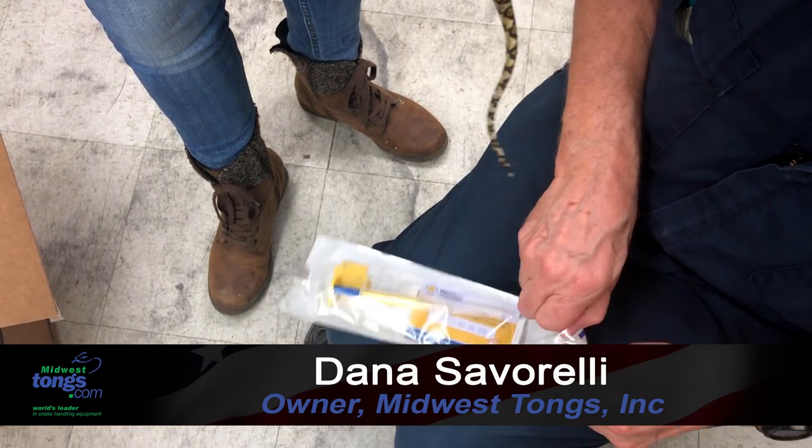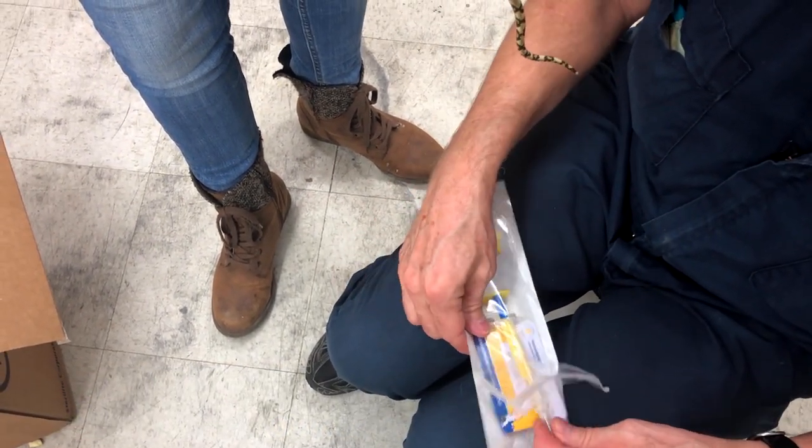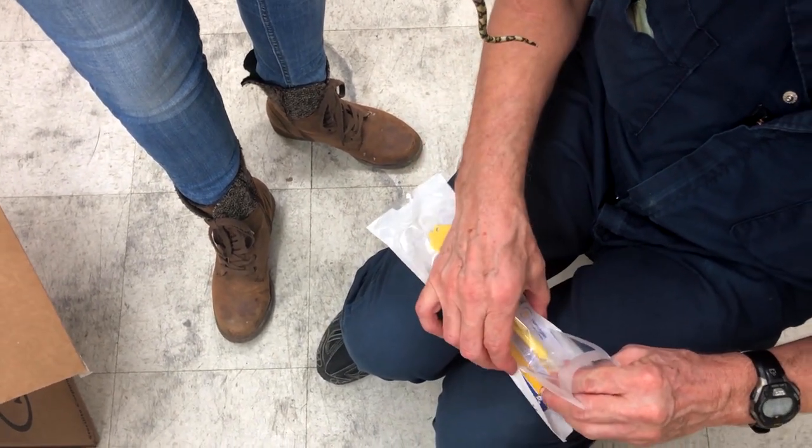We're going to microchip this little young reticulated python. Here's the chip, the needle, everything we need.